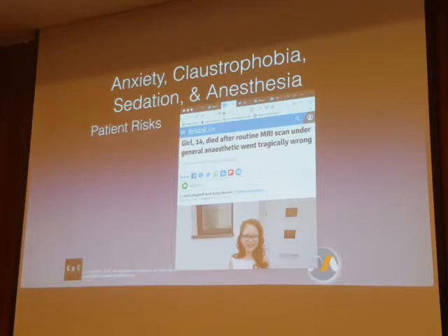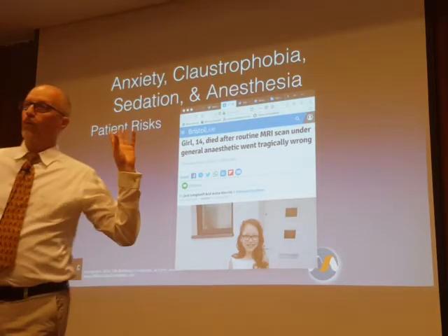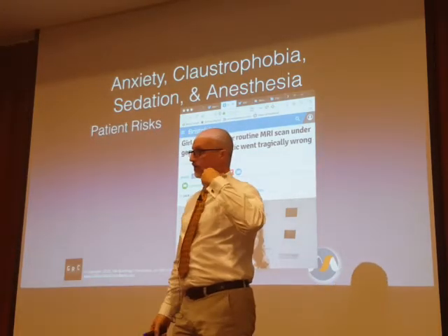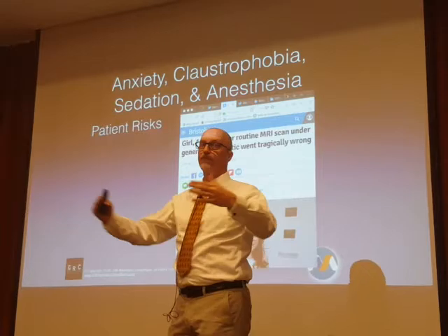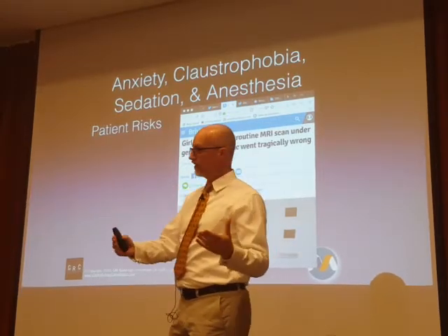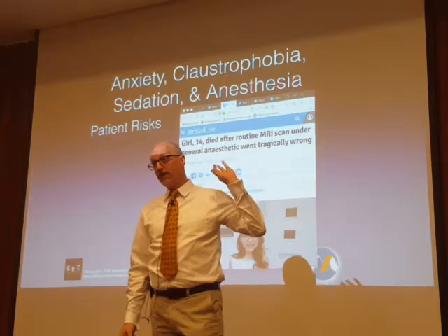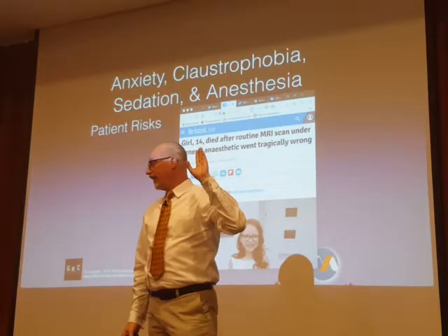Those procedures are in some ways as important as the equipment and the device itself. And when those policies, when those processes are not clearly defined for everybody in advance of a patient care situation, when something does go badly, there can be total chaos.